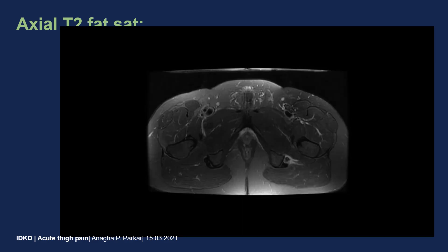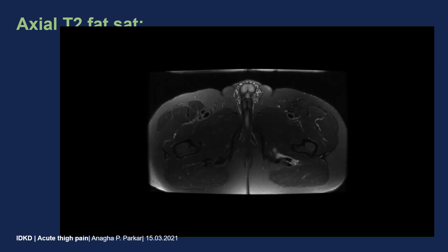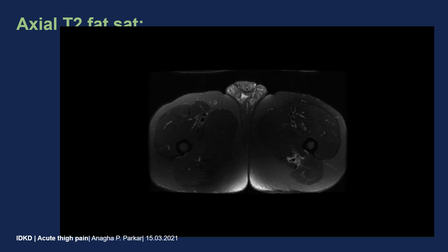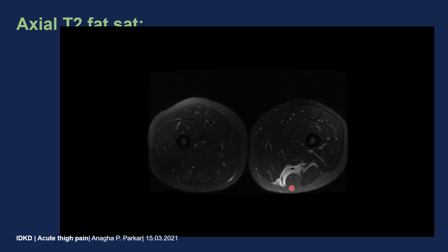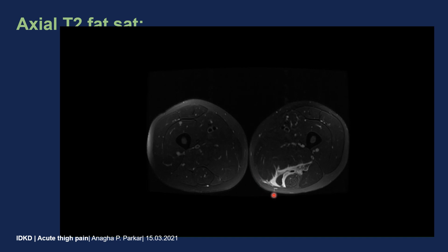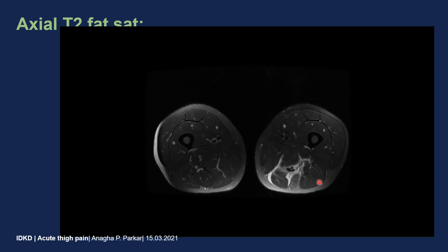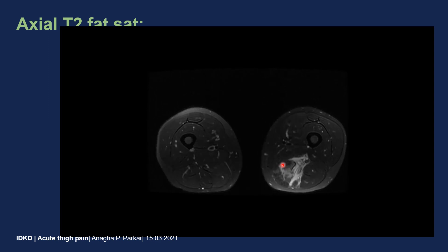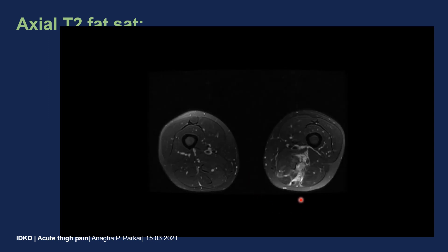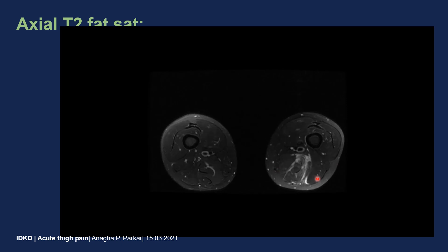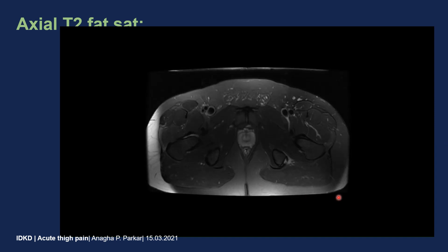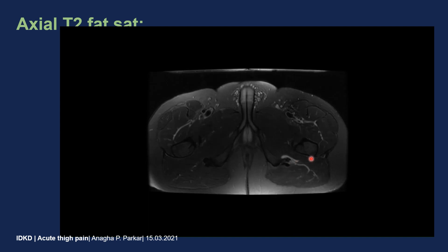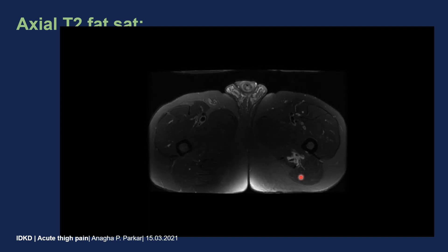This is the video of the T2 fat-sat image of that series. We see here an area with high signal on T2-weighted images. We also see high signal in the muscle. This is lateral, this is medial, so this is the biceps muscle, this is the semimembranosus, and this is the semitendinosus. There is high signal here along the tendon, but the tendon actually looks intact.